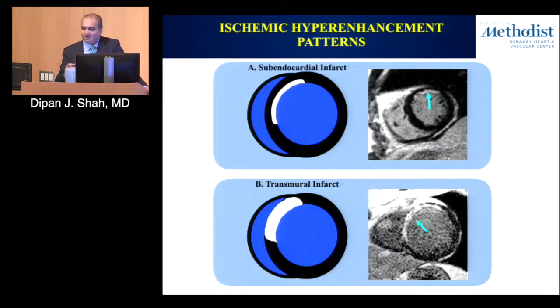And I think the unique thing about this technique, and again, to give you an idea of the scale, this is something that was developed about 15 years ago. So it's a relatively new technique, but the resolution that you get here is on the order of about 1.5 millimeters. So we're able to image about a gram of myocardial tissue. So you're able to detect myocardial scar with really exquisite resolution.